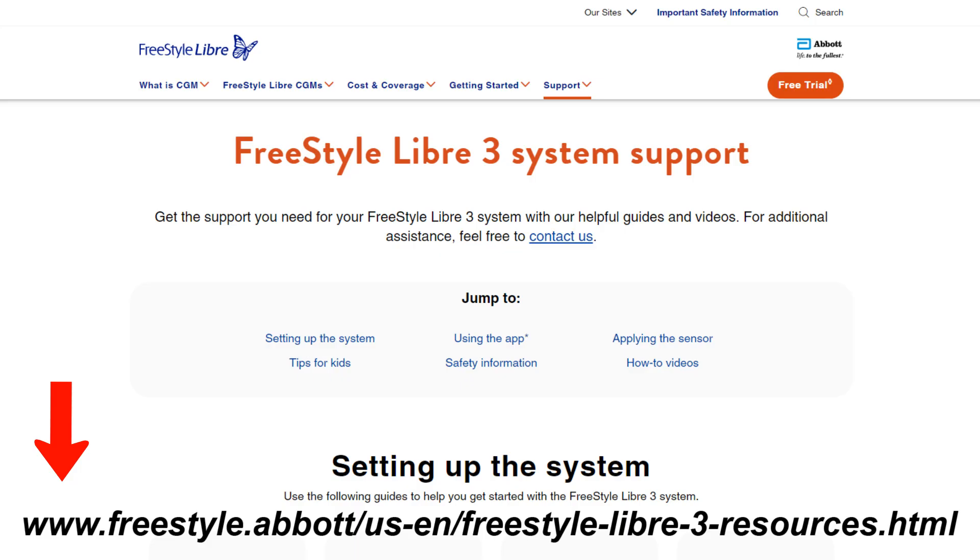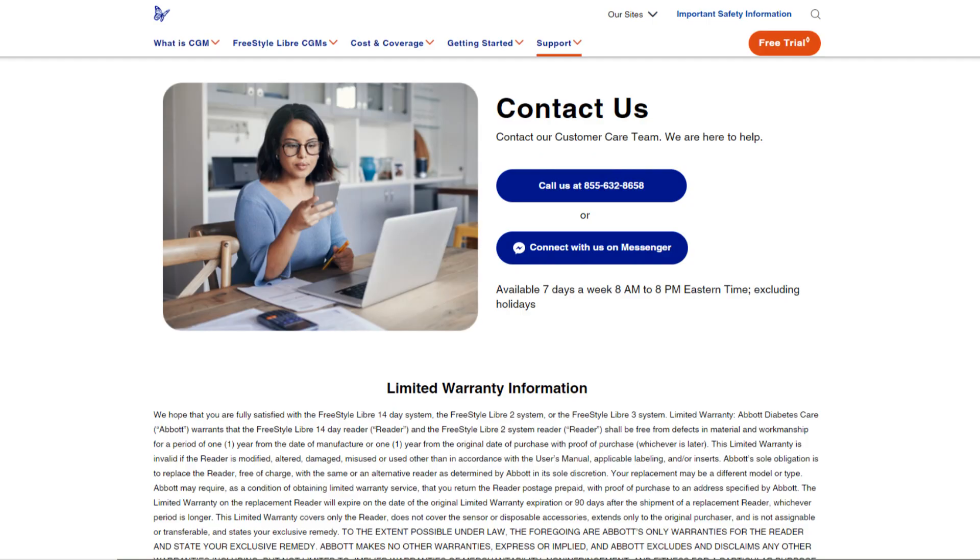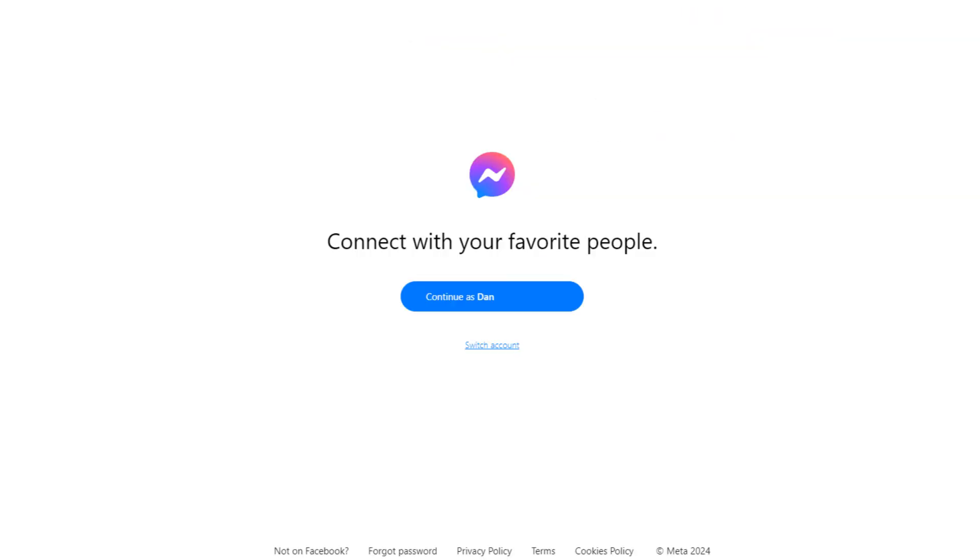I just quickly Googled 'Freestyle Libre 3 support' and it brought me to this page. Scroll down to the bottom and you get this section. From here, you can call their 800 number, or you can do a Messenger request.